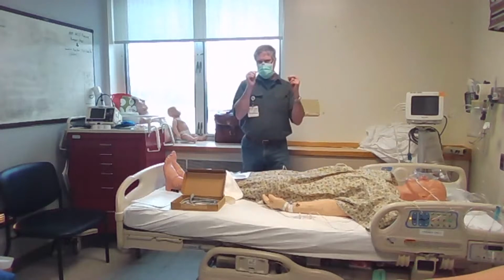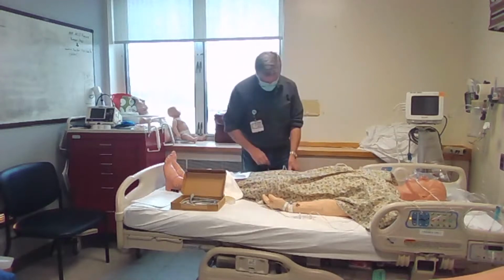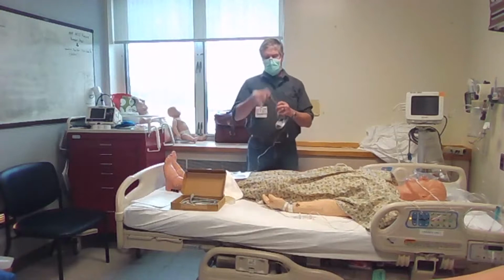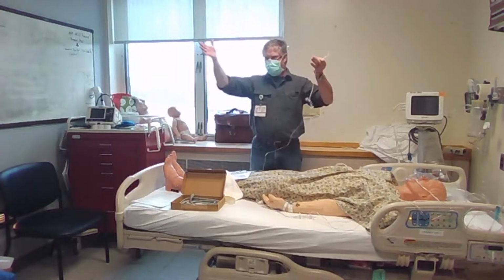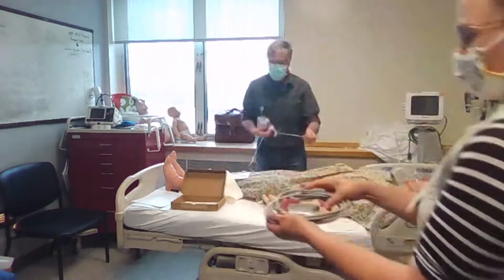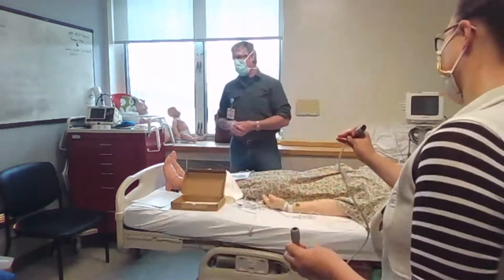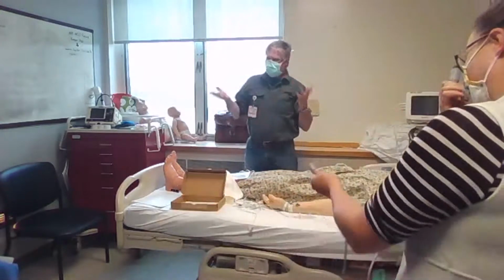The water's coming out of the tip of the needle, the blood's at the tip of the needle. There's a pulse that comes through, it travels into your transducer, goes through a wire, and is displayed on your screen. I think that's really neat. This is your special monitor. It's like a conductor. It's a conduit. Yeah, you could call it a conductor, but you think electricity.